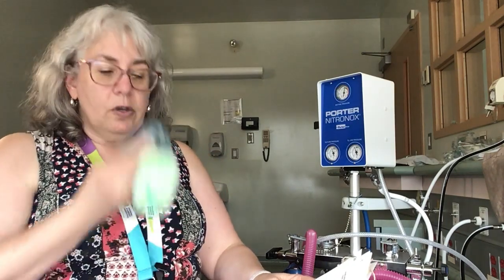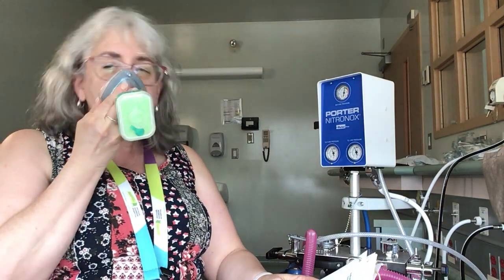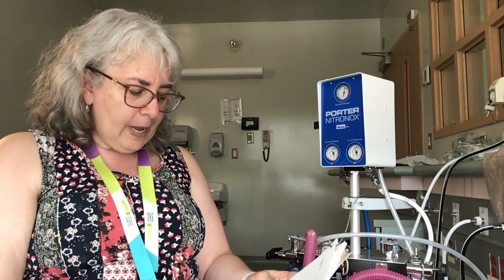So that is probably one of the most salient features of the need for education for the patient, is that they're holding their own face mask and somebody else isn't holding it for them. And then if they breathe too much and they get dopey, their hand is just gonna fall away, okay?